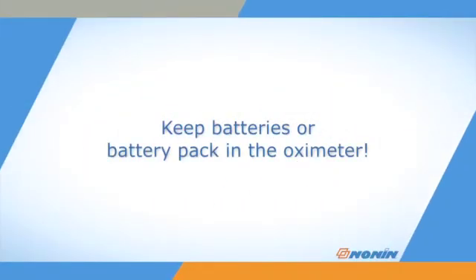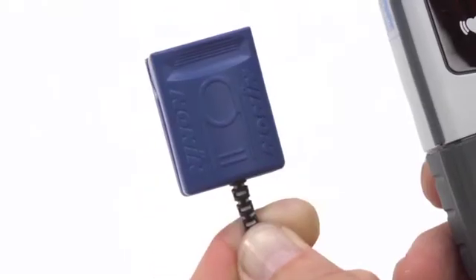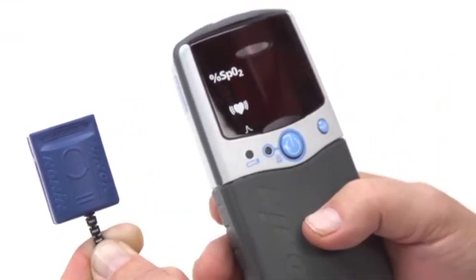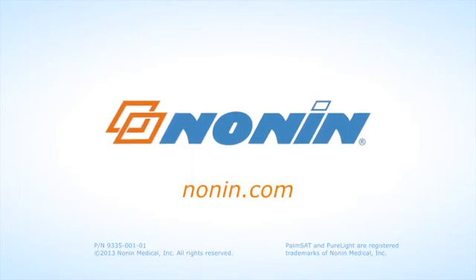Always keep the batteries in the oximeter to retain settings and stored data. With proper use, the Nonin PalmSat Model 2500 or 2500A pulse oximeter will provide consistent, accurate oxygen and pulse rate measurement. You can find additional use information on this and other Nonin products at www.nonin.com.